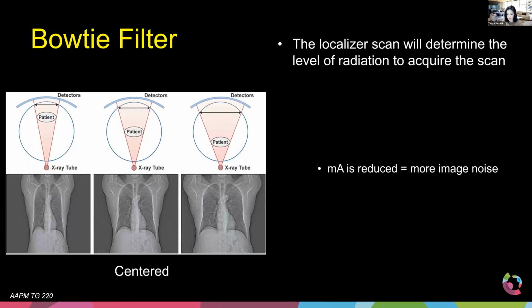Sam, about the tube current modulation among different vendors, they have different ways. Some say they use the two scouts, some say they have to do the frontal from the top, not from the bottom, and some say they use the last scout in the AEC. Some vendors use the information during the scan for the next scan, and some don't. So yep, they're quite complex.